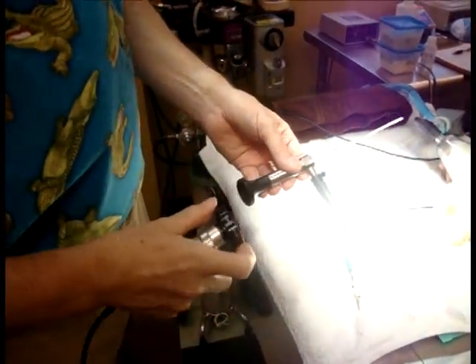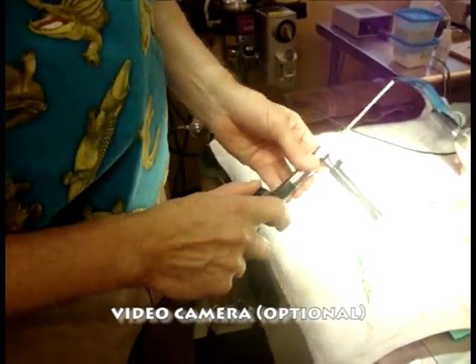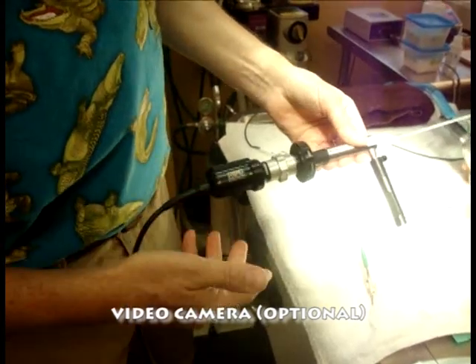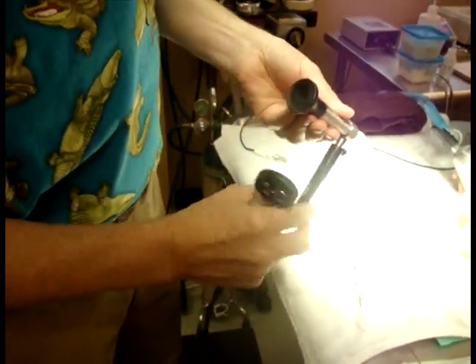For demonstration purposes, I'm going to attach this endoscope to my existing Carl Storz video endoscope system, just so I can document this for you all. But typically, I look right through the eyepiece when I'm doing my intubating.